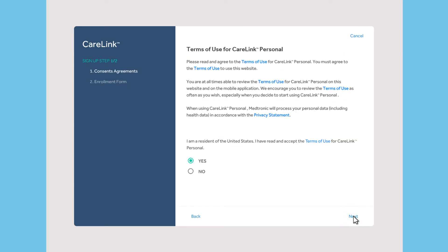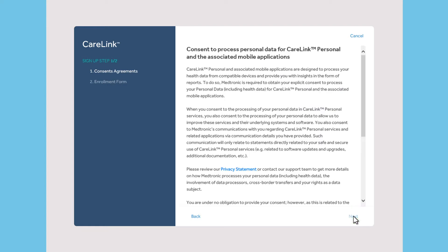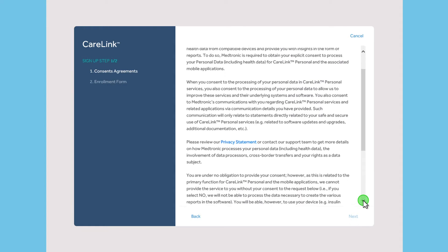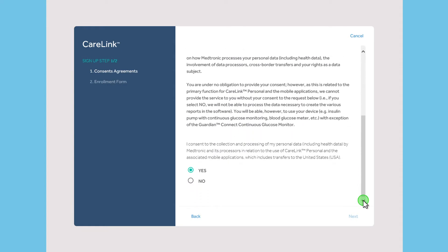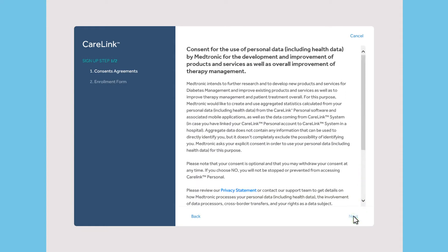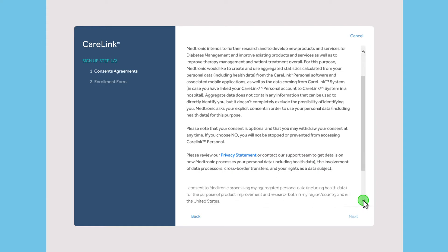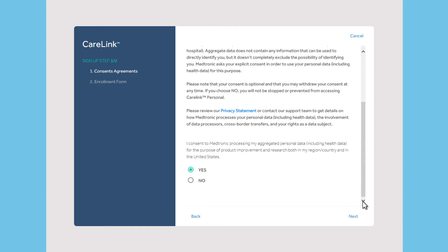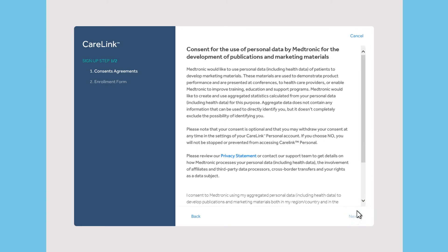Read the Terms of Use and select Yes to continue. Read through the prompts to complete the consent agreements. You may need to scroll down to see the entire message and agree.